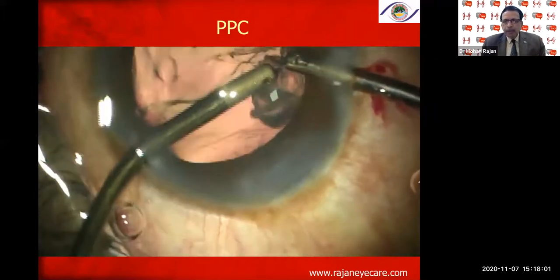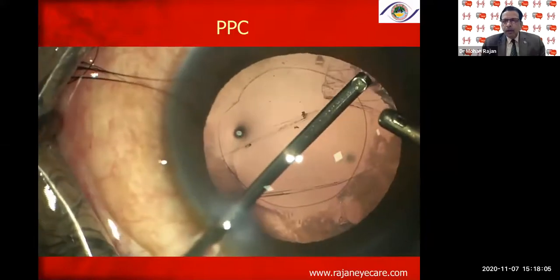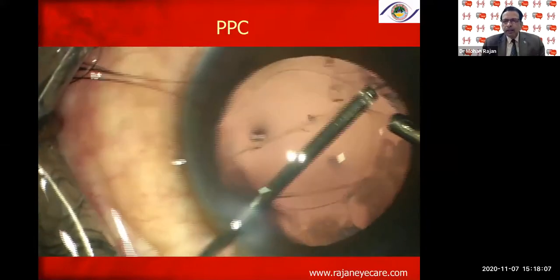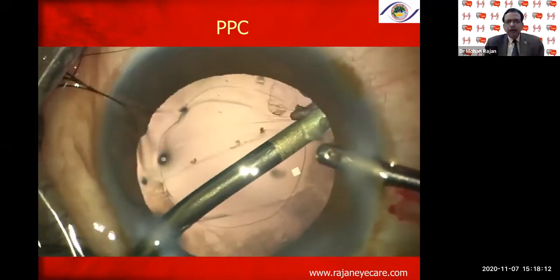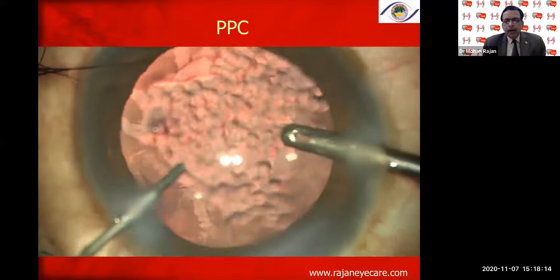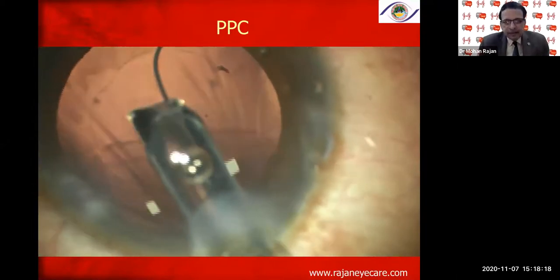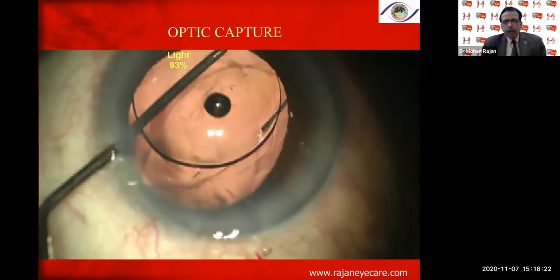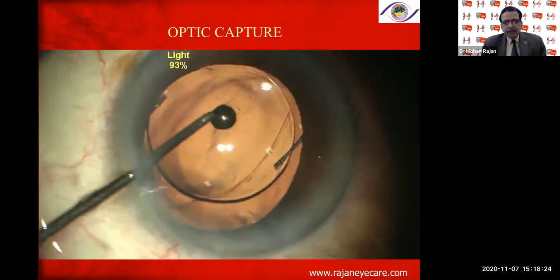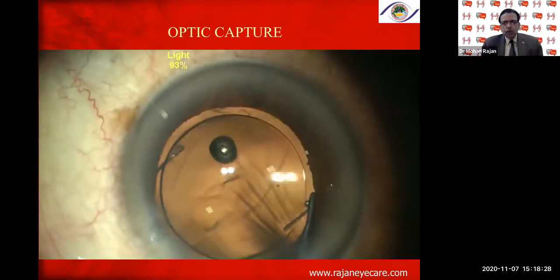Always remove the vitreous there, and you can inject Viscoat or any viscoelastic or Hyalon for that matter. Dispersive will be much better. Then come out of the eye, and you can see the typical two pillars on the posterior capsule, which is very, very typical of a posterior polar cataract dehiscence. And you can go ahead with implantation of the lens, a multi-piece lens in the sulcus, and capturing this lens. You can see here, I'm putting the multi-piece lens in the sulcus. Either a Sensar acrylic or an MA60 lens can be used, a foldable lens.